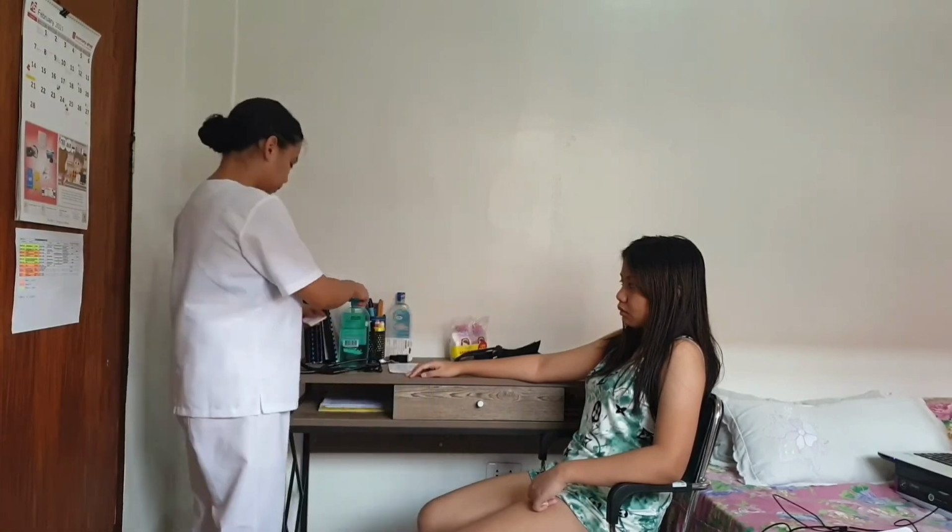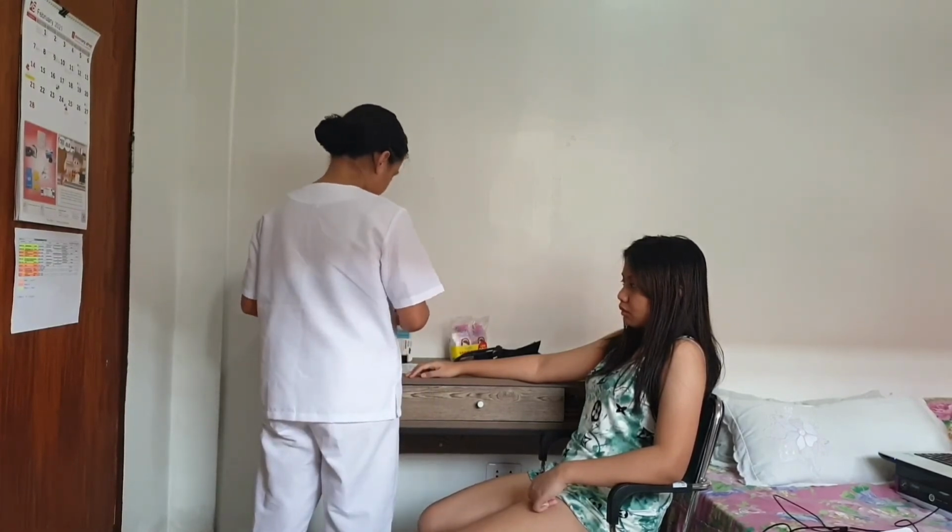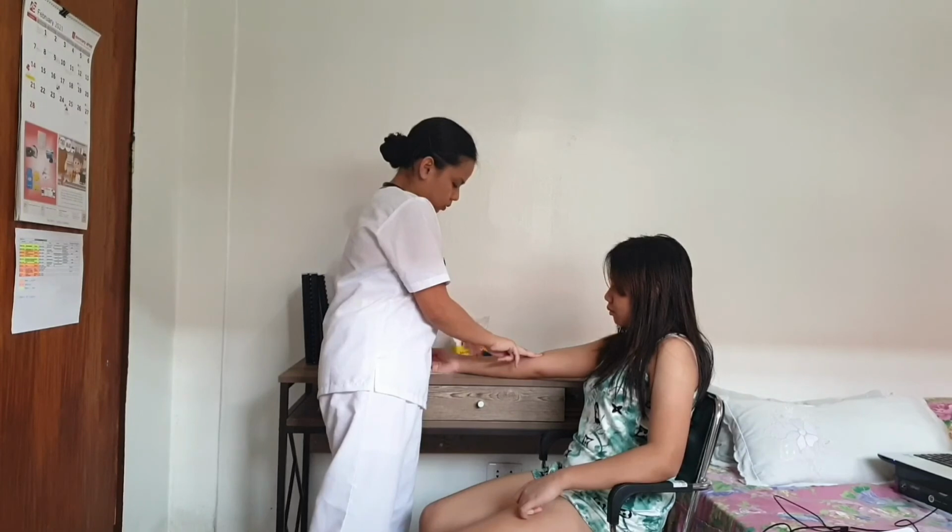But before that, I have to clean the earpiece of my stethoscope because if it is clean, I can hear the sounds properly. I am just going to clean it with an alcohol swab because I don't have wipes. I have cleaned my stethoscope already, so now I am proceeding to take her blood pressure.